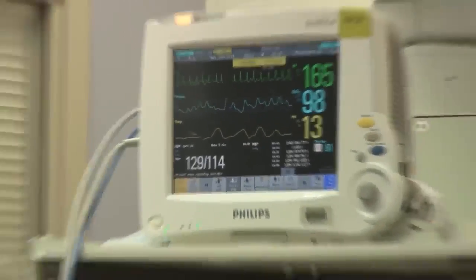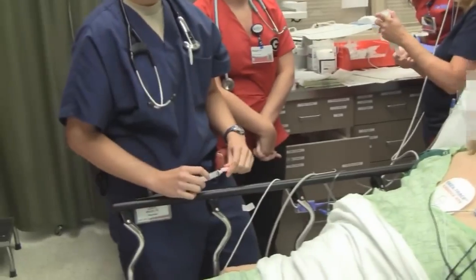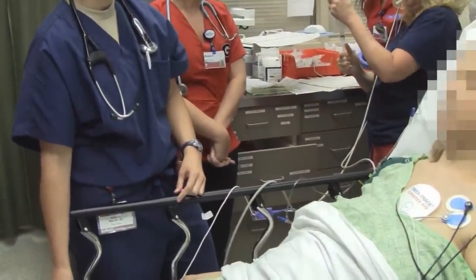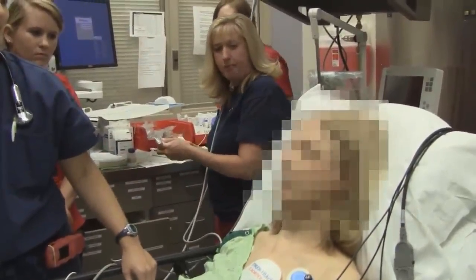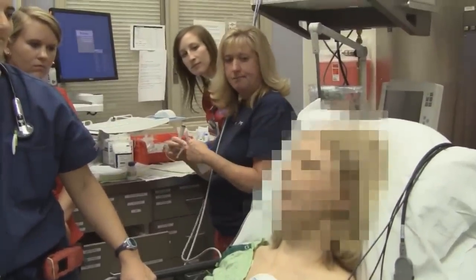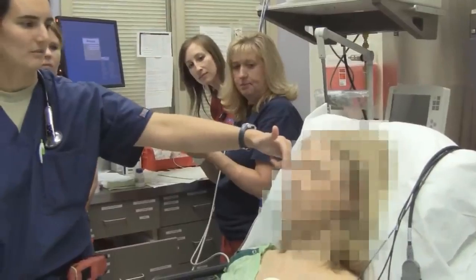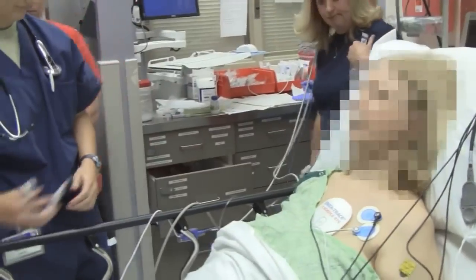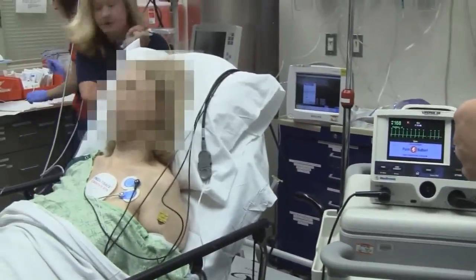How are you feeling? I'm taking a minute. Getting sleepy? No... I think she's going under. Okay, everybody ready? Everybody clear. So 50 joules — charging to 50, everybody clear. Clear. Clear. Got it — clear.